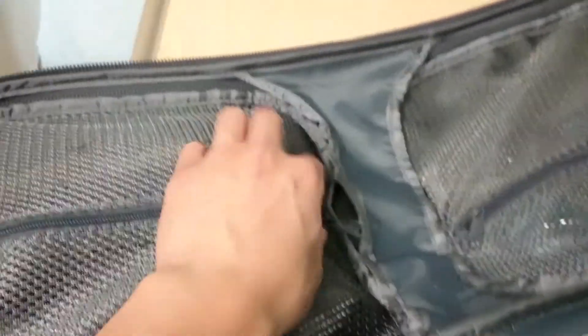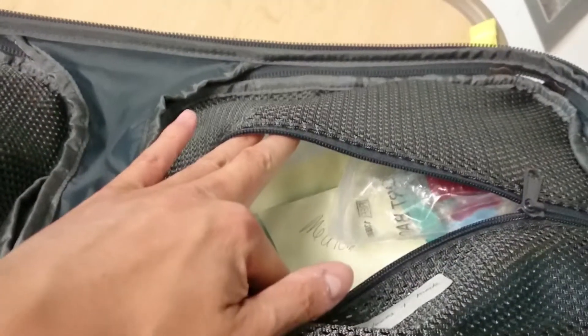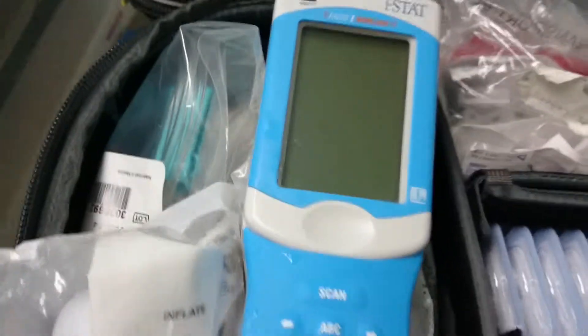On the top left-hand corner, we have the manual BP cuff, disposable stethoscope, ETCO2 tubing, and there's a hemostat and a pair of scissors in here too. Over on this side, there are some gloves and masks. Gloves are every size — just make sure when you use them to replace them if they're empty.